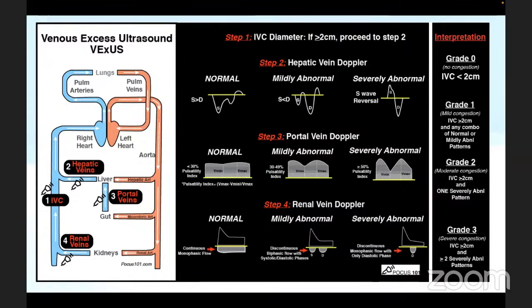Yes, sir. There are many conditions where we will not be able to assess or help. This is not the main aim, it is not to decide how much fluid we have to give, sir. All the studies done to date are done in resuscitated patients or in patients who are already in established hypervolemia, in whom there is a chance of reducing the fluid administration.